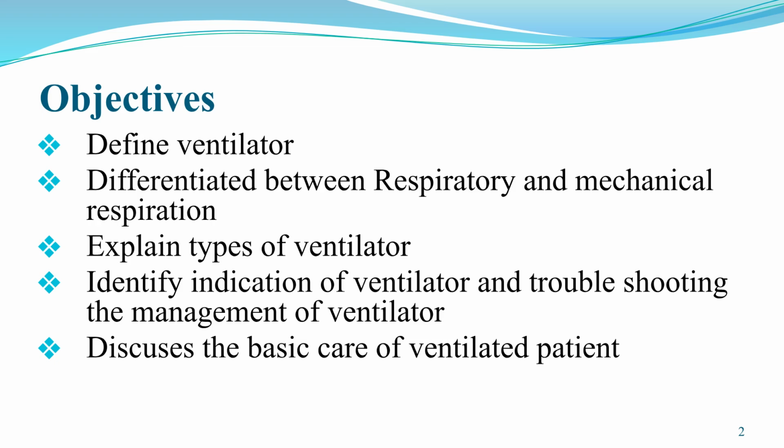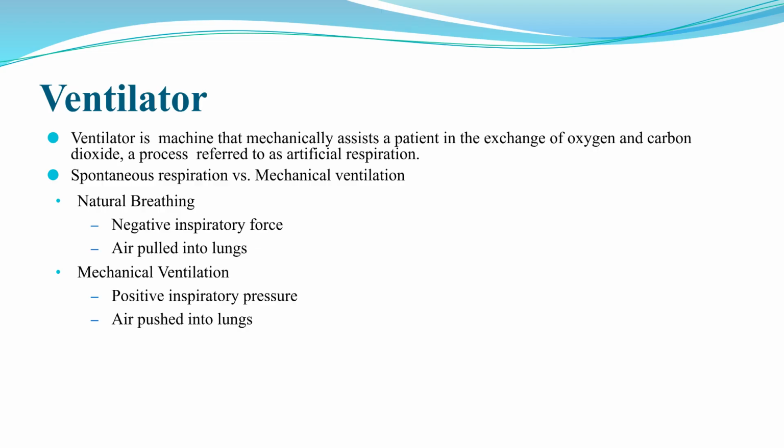Our objectives include defining a ventilator, differentiating between respiratory and mechanical respiration, explaining ventilator types, identifying indications, troubleshooting management, and discussing basic care for ventilated patients. A ventilator is a machine that assists with the exchange of oxygen and carbon dioxide, known as artificial respiration.